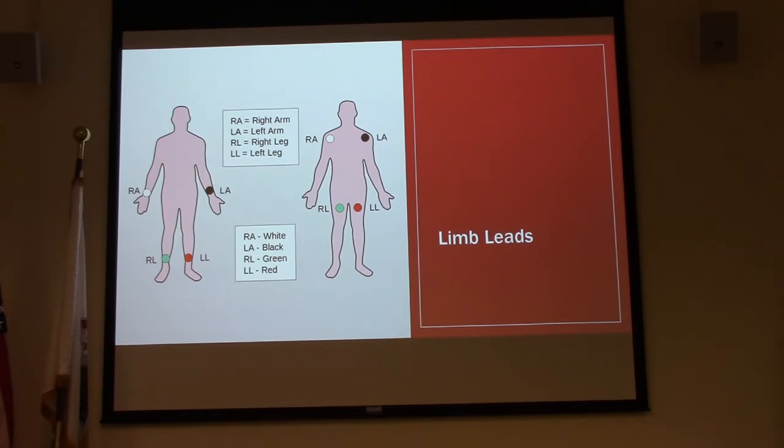You will miss a great deal, almost 50% of all STEMIs, by putting them on the thorax. This is the new way they're talking about it. I just pulled a study about putting them on the arms and then the mid-thighs, and they're saying that's fine too, but to me it's harder to get to those areas, so why not just use the ends of the limbs?